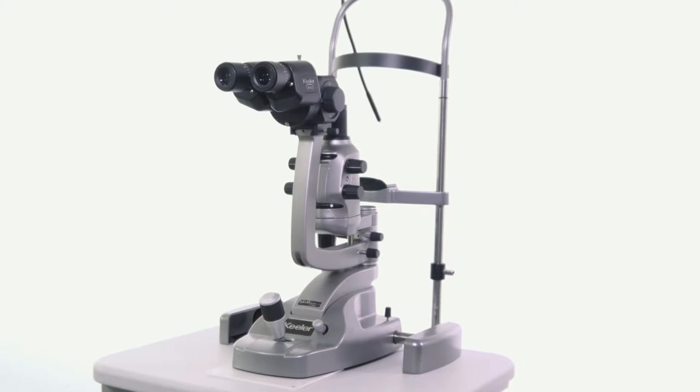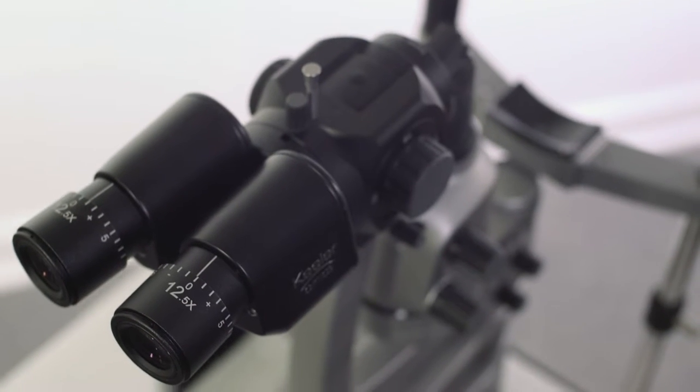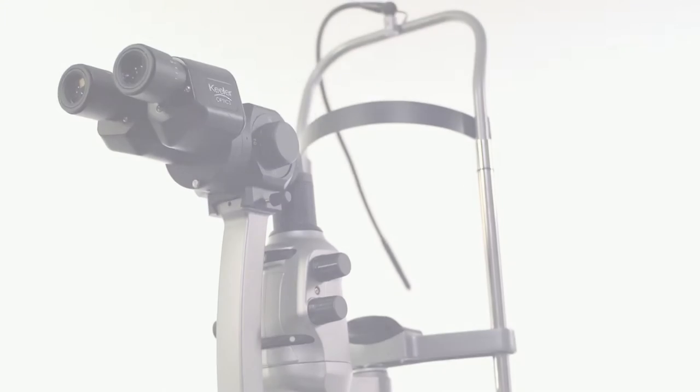The Z-Series slit lamp is our lower illumination compact system that is used for examination of the anterior segment and posterior segment of the eye. This video will provide an overview of the features of the Z-Series and instructions on how to use it.